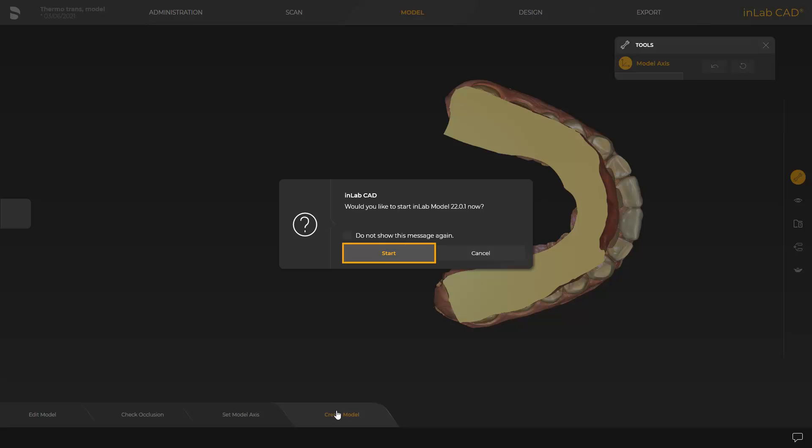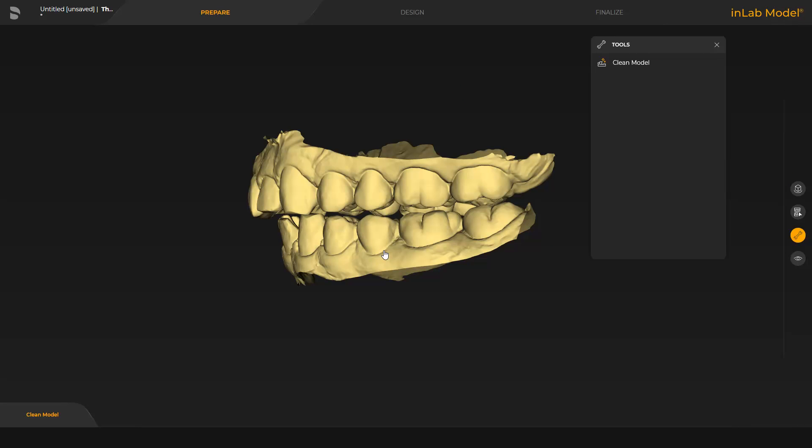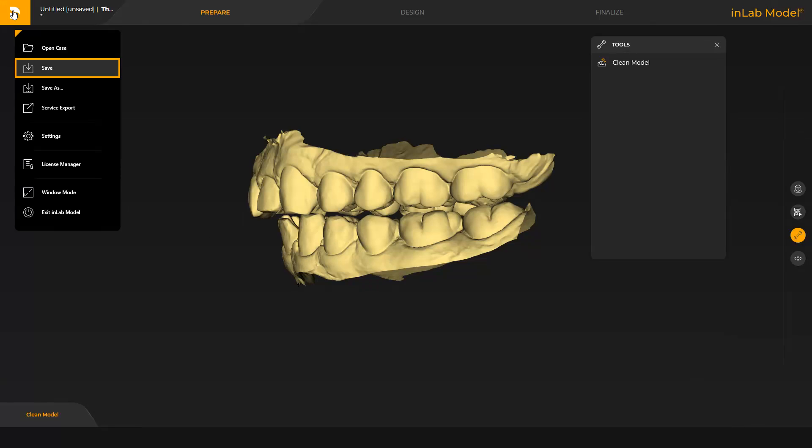We confirm with Start and the case is automatically opened in the InLab model app. First, we click the Dentsply Sirona icon on the upper left and save the case.